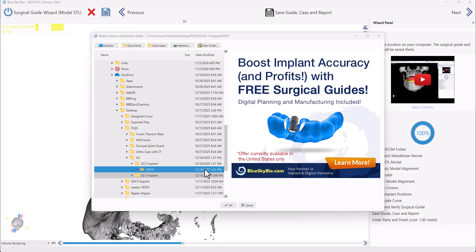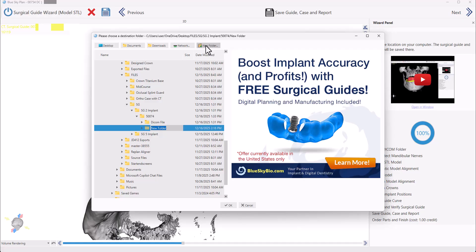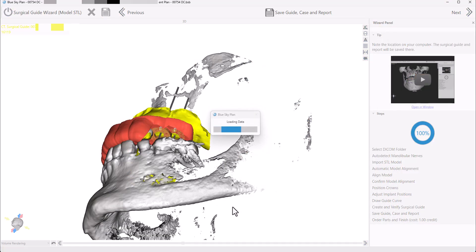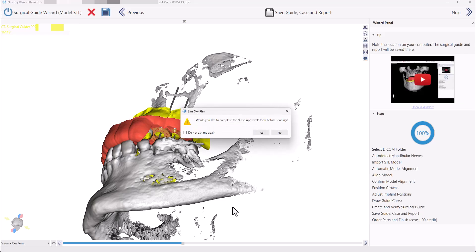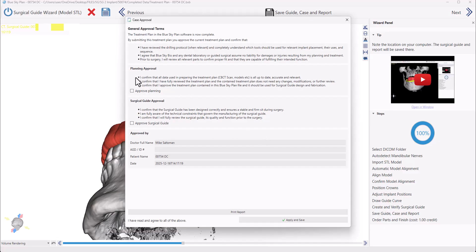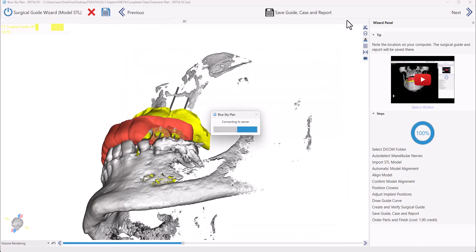We're going to choose the location where the case, the surgical guide, and the report should be saved. I'll go back to my patient folder, click New Folder to create a subfolder, and call this 'completed data.' Press Enter and then click OK. Now the project is being saved to that location and the surgical guide has been exported and saved there as well. Would you like to complete the case approval form before sending? If you are sending this case to somebody else and would like to confirm the planning and surgical guide, you could do so. Otherwise, there's no need, and there was a checkbox for 'don't show me again' which you could take advantage of if relevant.